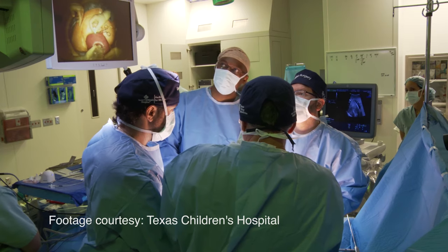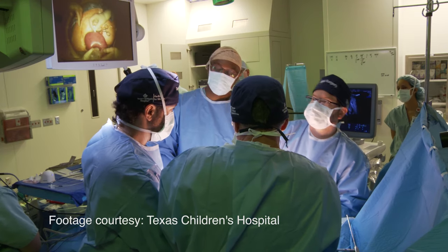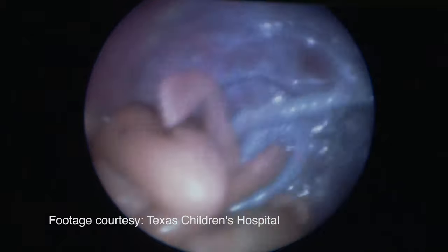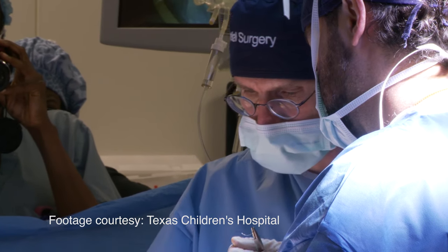During these fetoscopic surgeries, there's no way to measure the fetus's blood oxygen, and they're being exposed to general anesthesia just like the mother, and just like the mother, they need to have their blood oxygen monitored.